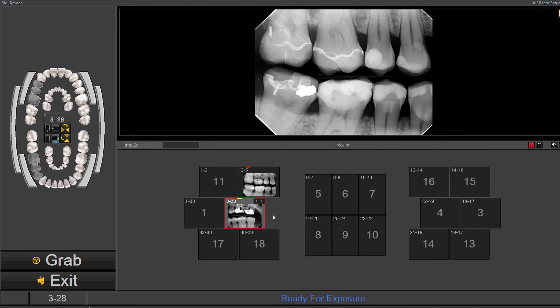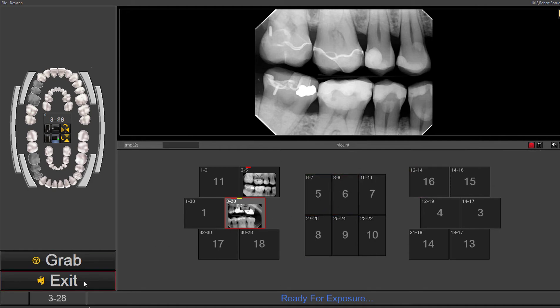We can rotate it and put it in different orientations as well. So when you're dealing with an emergency, you can override the sequence, acquire images under a specific tooth number, take multiple images in the same box, and it will all be saved.